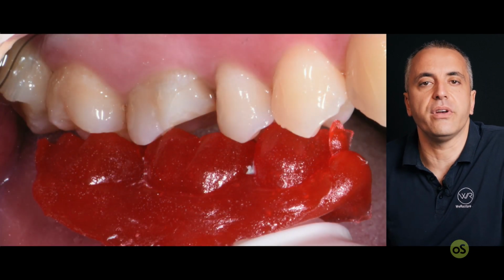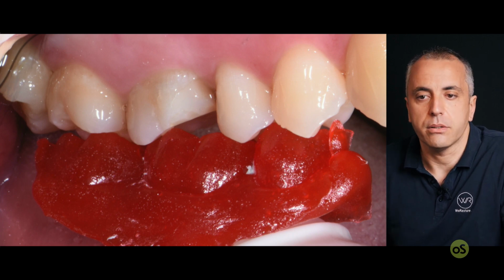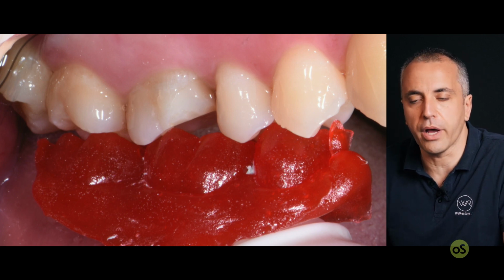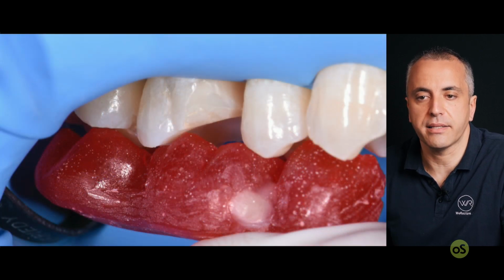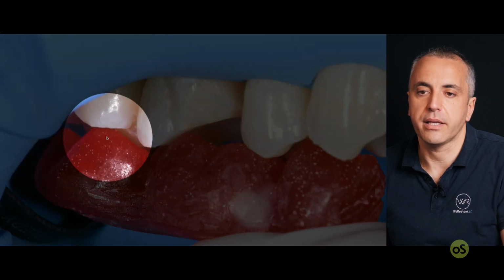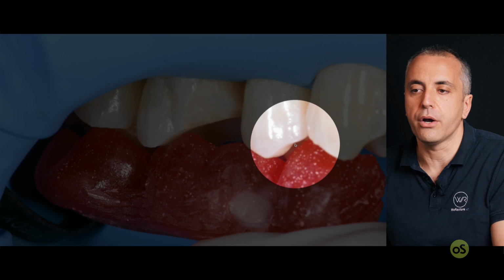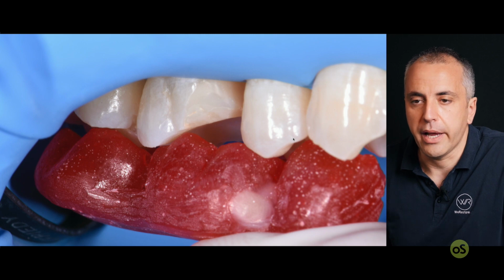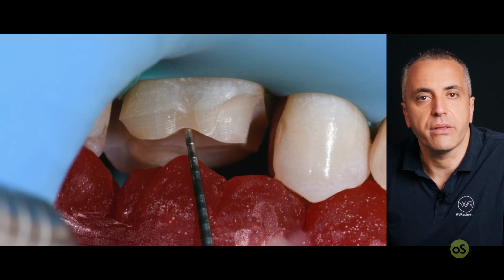You see, the mesial is not very finished yet, but before finishing, you have to check if it is stable. Here we have just a few teeth, but it's more than enough, so we can go and isolate our teeth. So this is how it works. You can take some references, for example, check visually this reference and mesially this reference, so that when you reposition it, you can always check if it is in the correct position. And as you can see from this picture, you can use a probe during the preparation to check the thickness continuously.